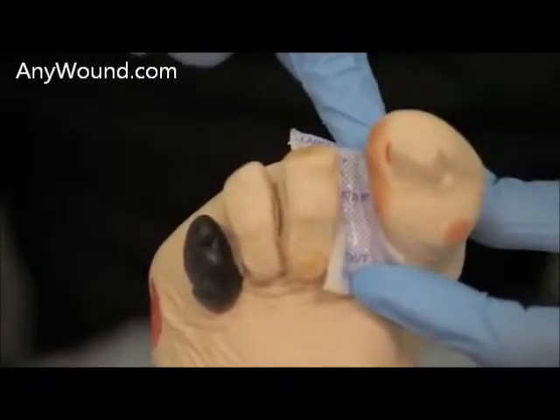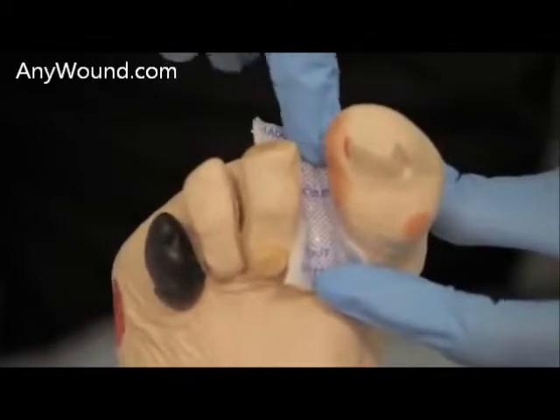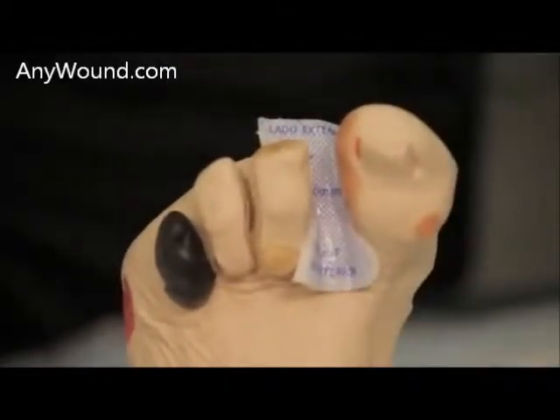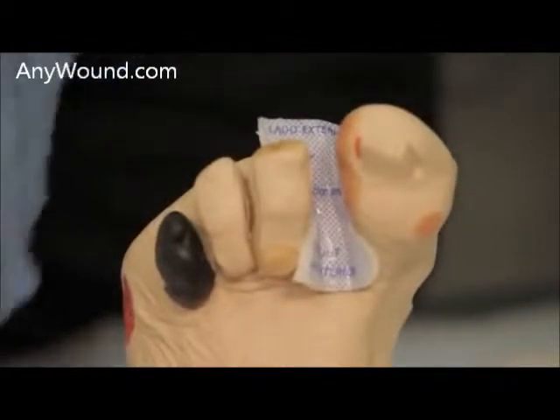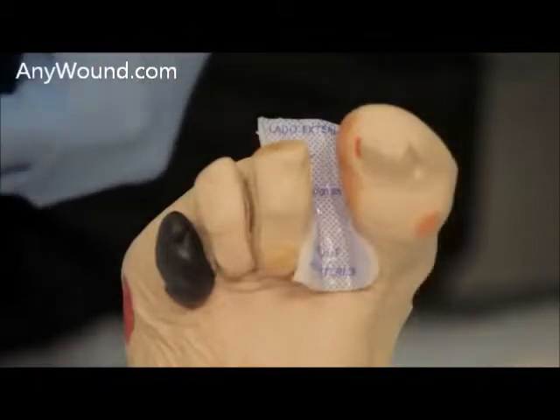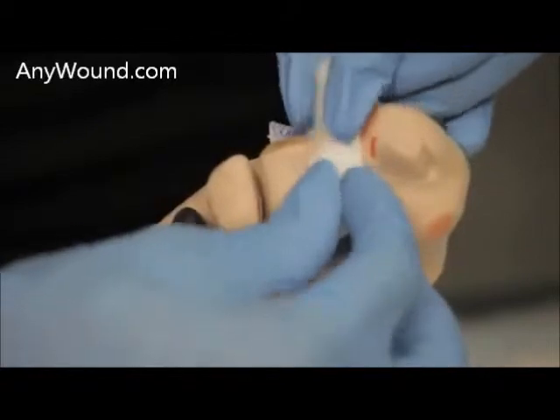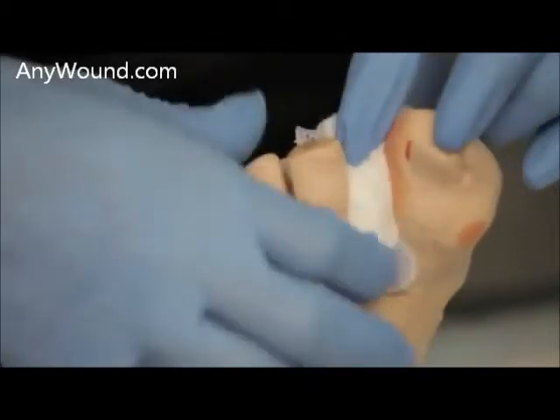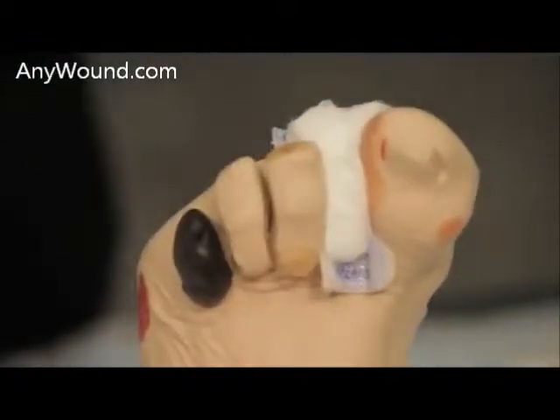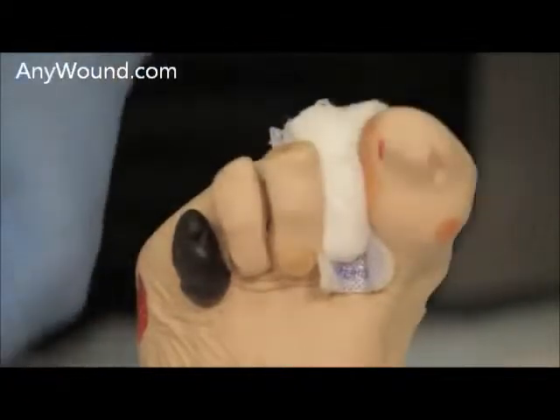Now you've applied it and made contact with the wound. To further ensure that you will make contact with that space, you can add a small piece of gauze into that area, which will ensure full contact. Then you'll want to secure the whole area with just some cotton tape.